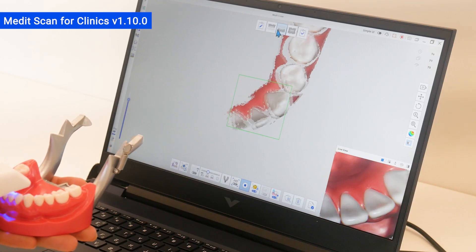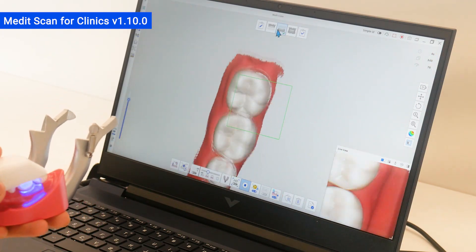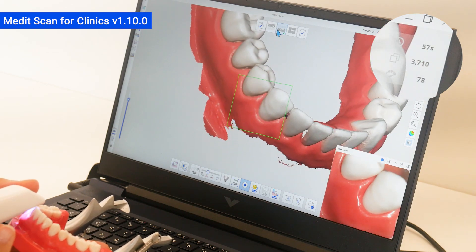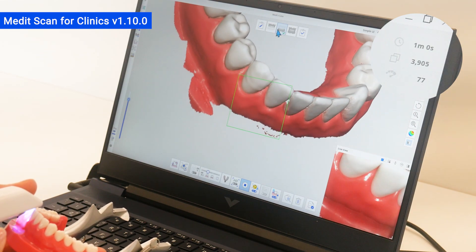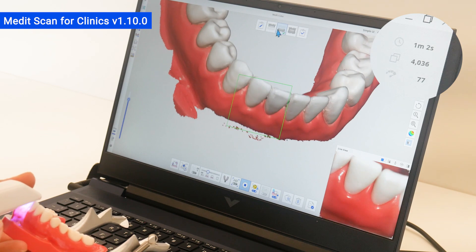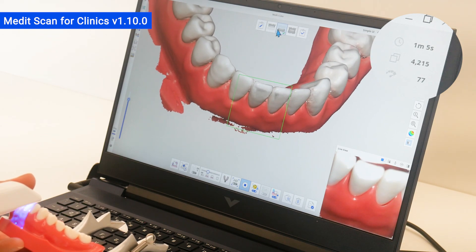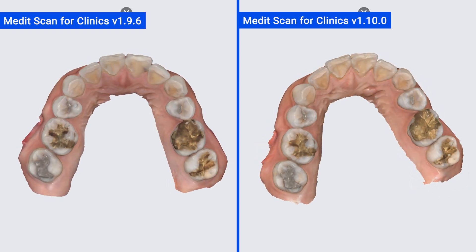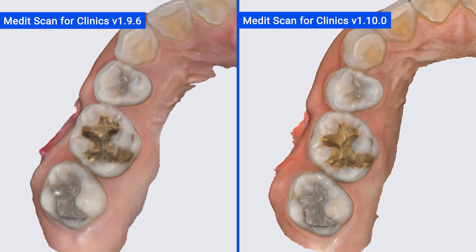Moreover, we improved to maintain the best scanning performance without FPS drops even when the number of scanned images increases or data is scanned in multiple stages. And we optimized the post-processing parameters of the acquired data to improve the sharpness and detail of the scan data.